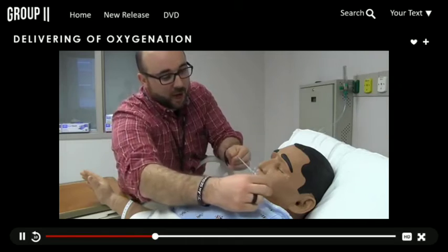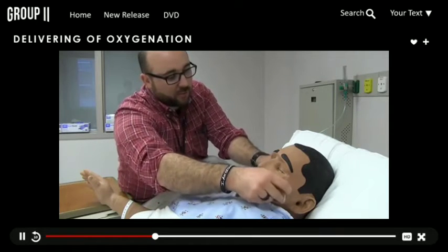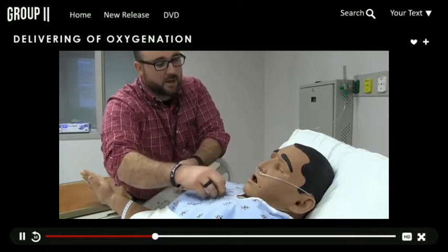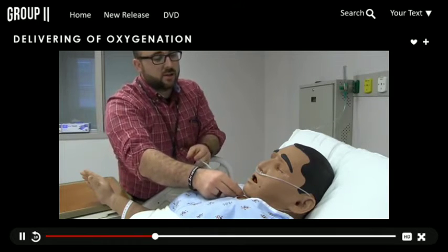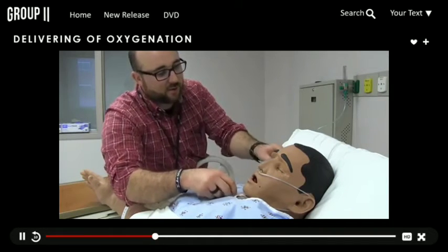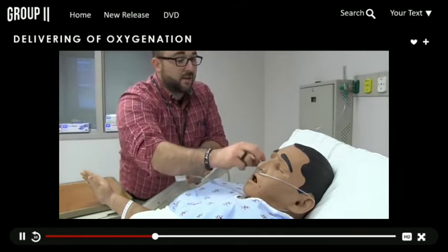So curving back, I always put it in the nose first, a little bit of pressure. Of course, I'm going to put it around this ear, and then I'm going to show you for this side how it goes over the ear and under the chin, and then this piece right here kind of goes tight. You don't want to go too tight with it, just enough to secure it. And then sometimes I do a little bit of adjustment to what feels best for the patient. One real key, don't do it too tight.